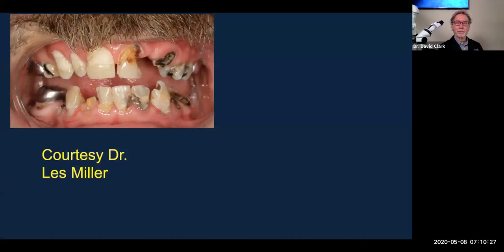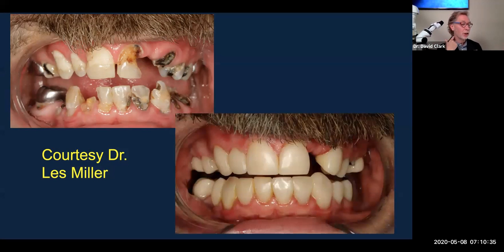So just to one up me here, this is Dr. Les Miller who did an injection overmolding case with selective caries retention. Ready for this? Boom, right? So you get good at this, it impacts your treatment planning. Injection overmolding is a third modality. We have bonding, which is okay. We have crowns. We know that crowns work. We have injection overmolding. It's a third modality. And that's the way that we're thinking about it now.